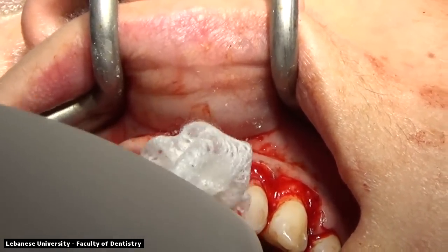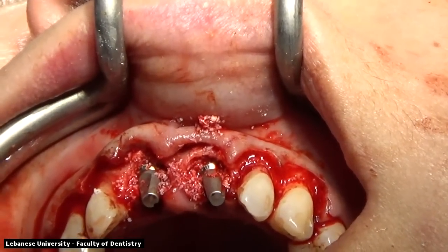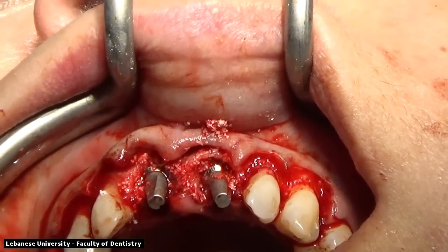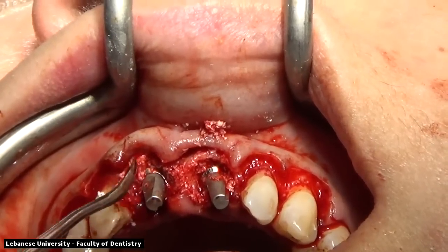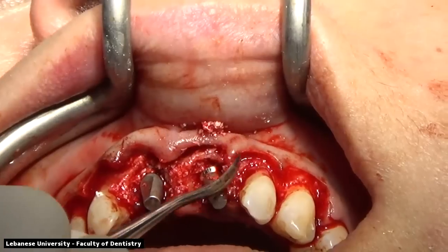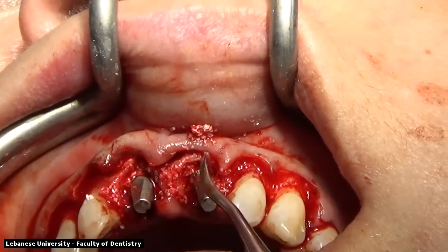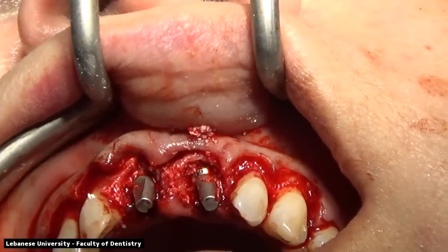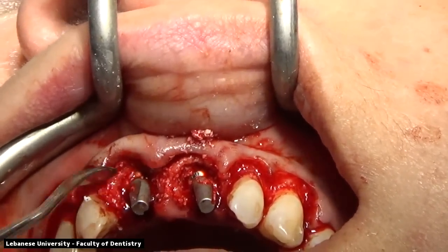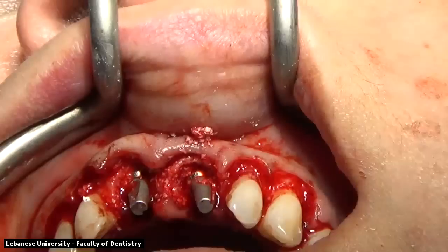We're drying off the site with a wet gauze to make sure that the bone is in the area where we need it to be and to take a look and see if there's any additional bone graft that might be needed at the site. Removal of the excess bone graft material in between the two implants and at the periodontal ligament area of the neighboring dentition.